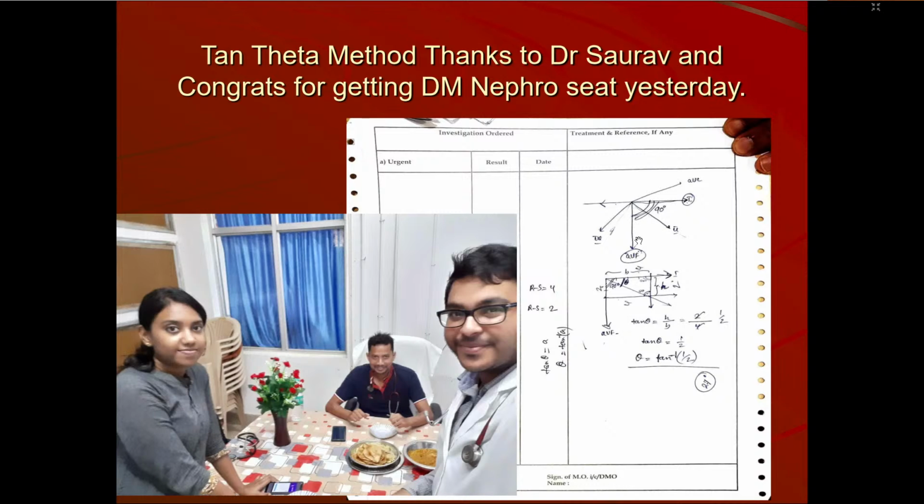It becomes a rectangle. You draw a diagonal, and it becomes 2 triangles. For this triangle, AVF is giving the value of the height of the triangle. This is the height, and lead 1 becomes the base. So tan theta is height by base, which is 2 by 4, equal to 1 by 2. So tan theta equals 1 by 2. So theta equals tan inverse.